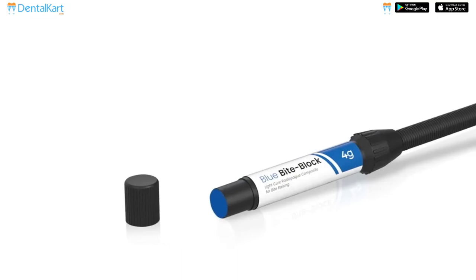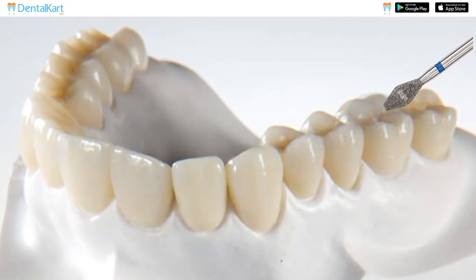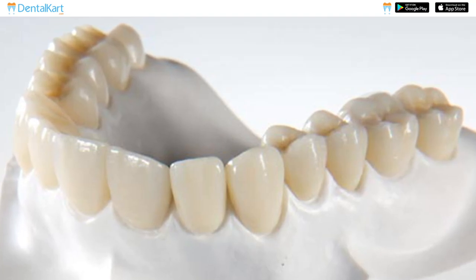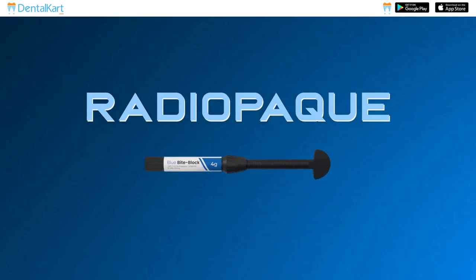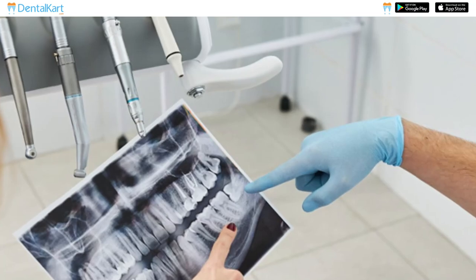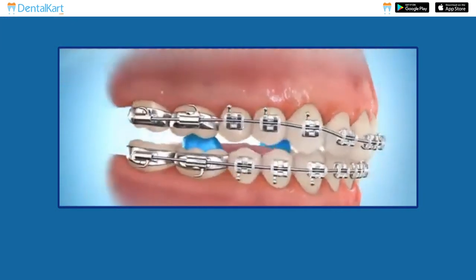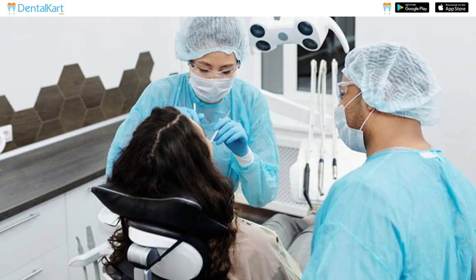Walden Blue Bite Blocks are designed to minimize the loss of tooth structure during removal, ensuring the preservation of the natural teeth. These bite blocks are radio opaque, allowing for clear visibility on dental radiographs and aiding in accurate diagnosis and assessment. They exhibit outstanding wear resistance, ensuring their durability and longevity in clinical use.